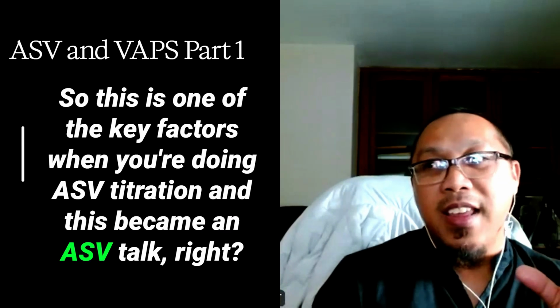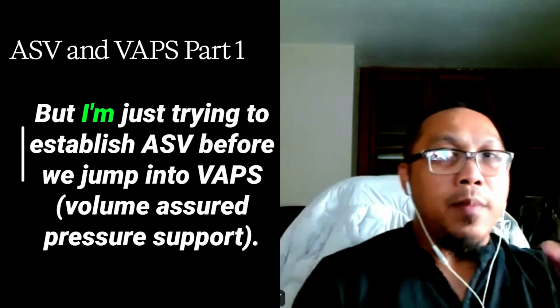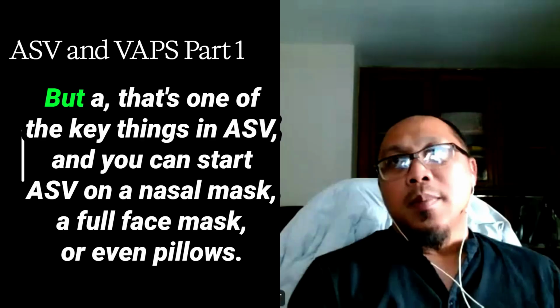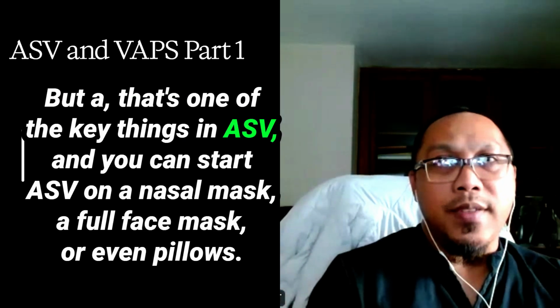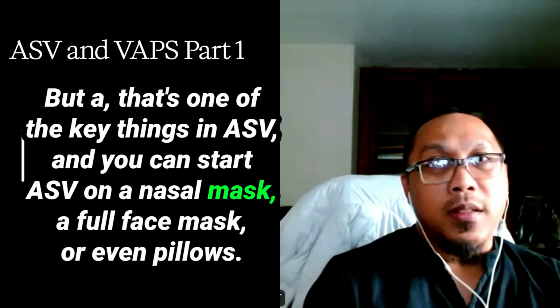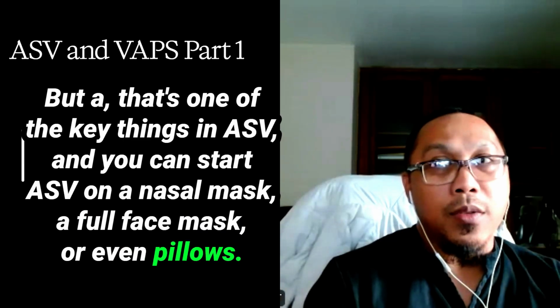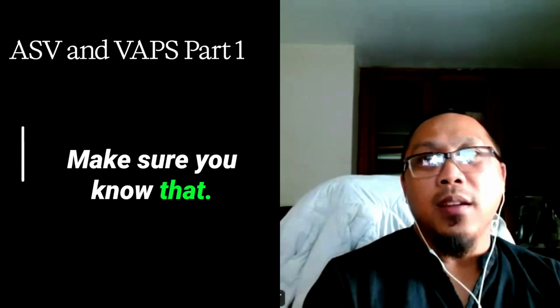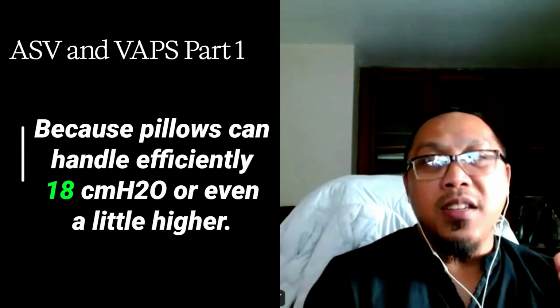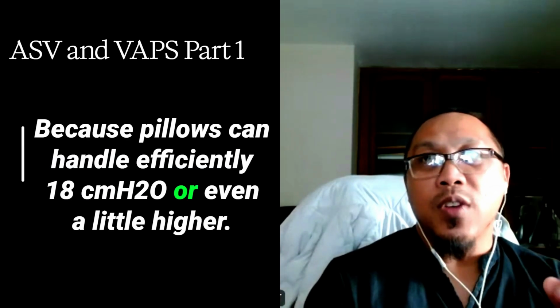This became an ASV talk, right? But I'm just trying to establish ASV before we jump into VAPS. But that's one of the key things in ASV. And you can start ASV on a nasal mask, a full face mask, or even pillows. Make sure you know that because pillows can handle efficiently 18 centimeters of water pressure or even a little higher.